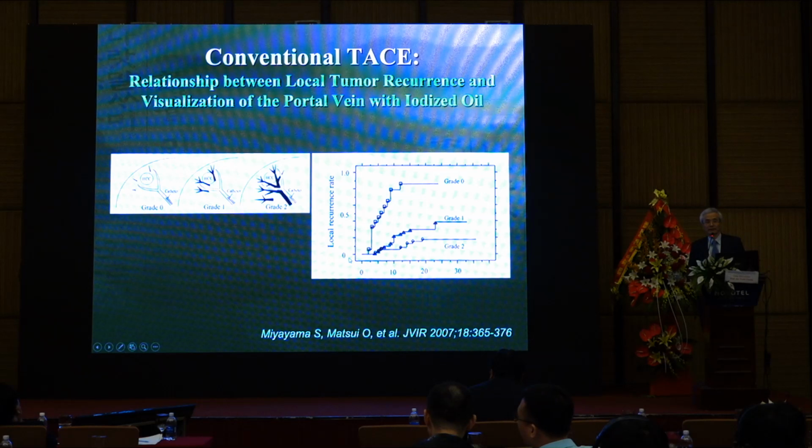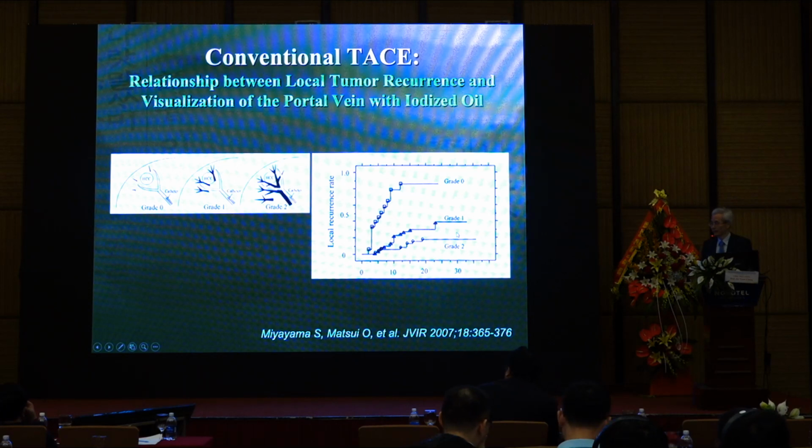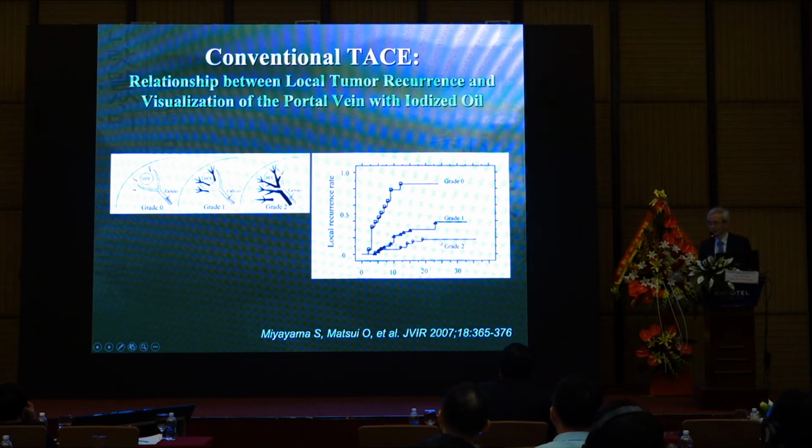Dr. Miyayama in Japan nicely demonstrated the relationship between local tumor recurrence and visualization of portal vein. If the peritumoral portal vein is well filled with Lipiodol, here you can see the long-term recurrence rate is less than 30%.